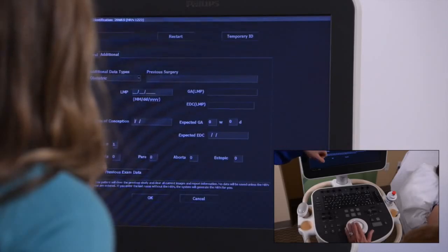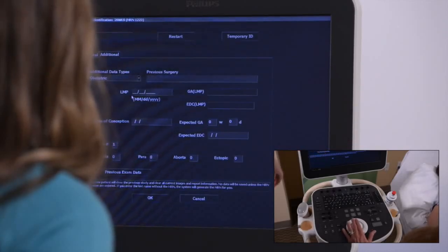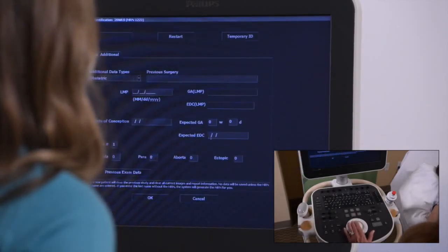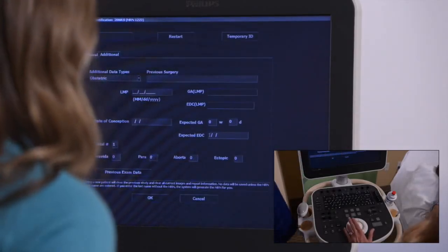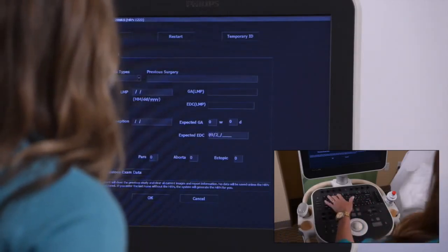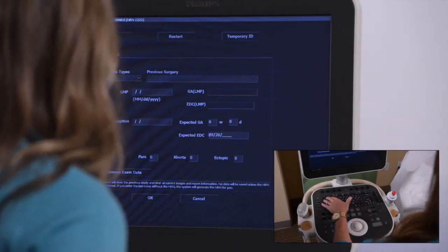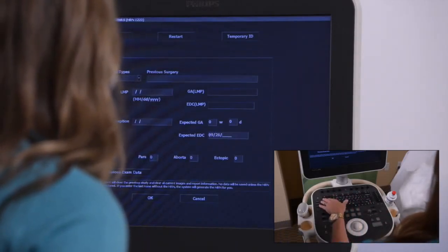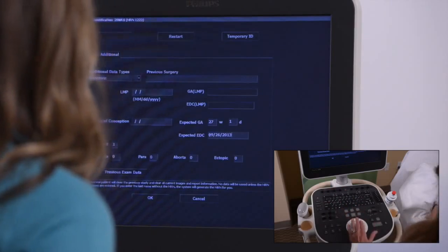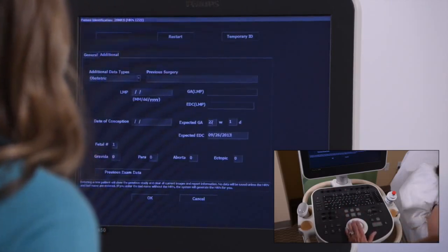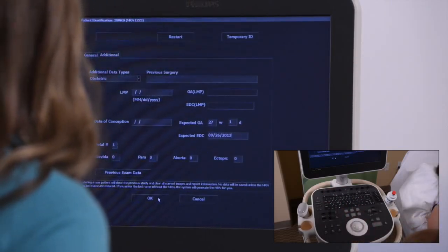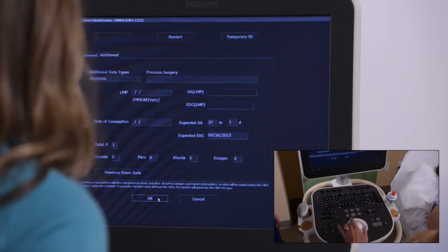And then the due date here. Do you know your due date? September 26th. Okay, and then that generates how many weeks she should be today. And then we just hit okay? Yes.